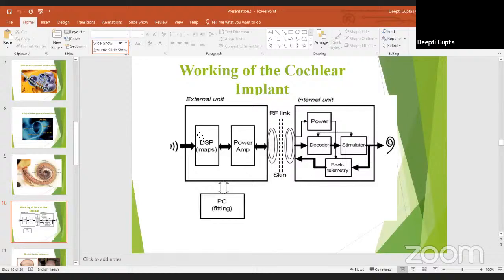and it extracts the features from the sound. What kind of features? Simply the pitch, the intensity of the sound, or who the speaker is, like we can identify whether the speaker is male or female. And now the techniques are getting so advanced that we are able to identify, like a normal person, exactly who is speaking. So many kinds of feature extraction we can use. How we are going to use it, I'll explain a little later.